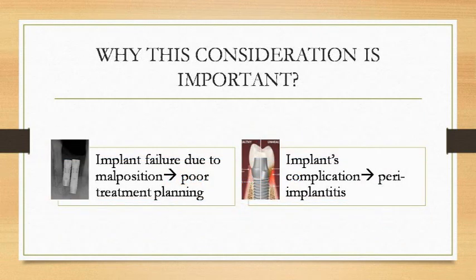These are a few examples of why good treatment planning is important to both the clinician and the patient. Treatment planning is important to prevent unfortunate events like malposition of the implant. Malposition could be that the implants are placed too close to each other, where certain millimeters have to be considered if two implants are going to be placed adjacently. This malposition could make the restoration of the prosthesis impossible in the near future.